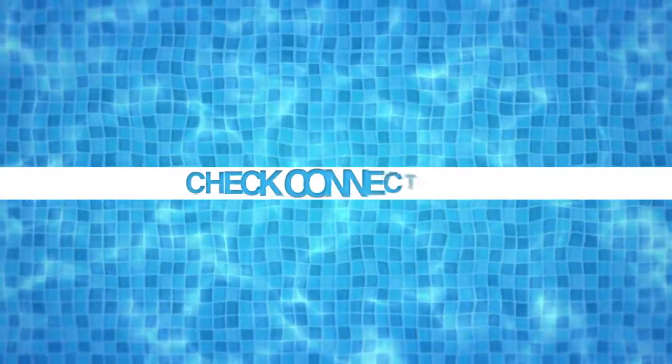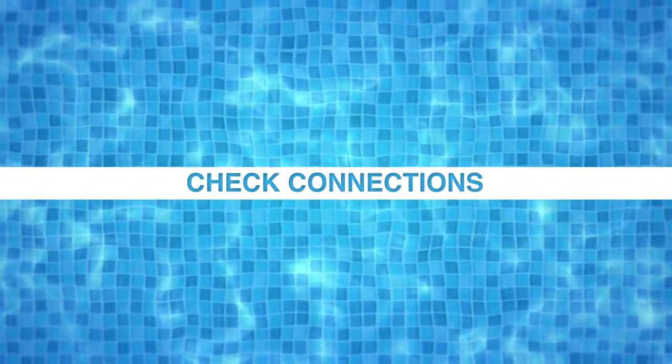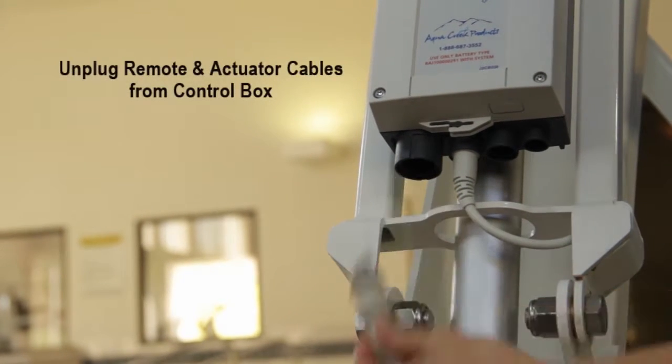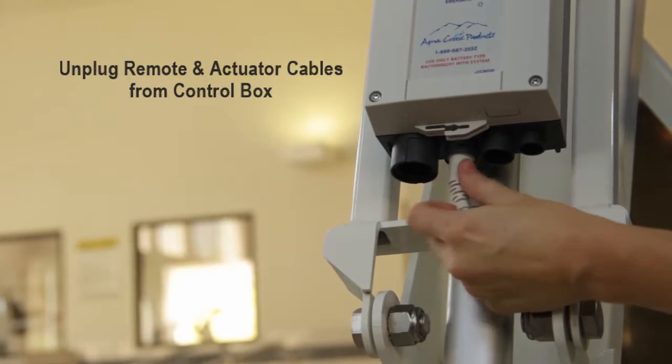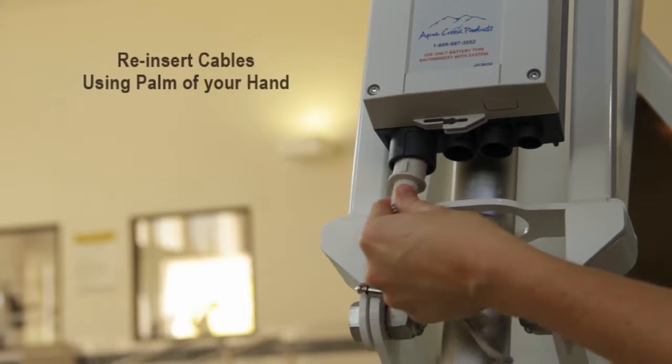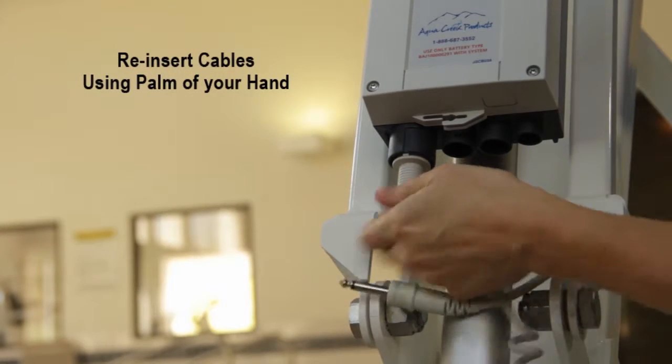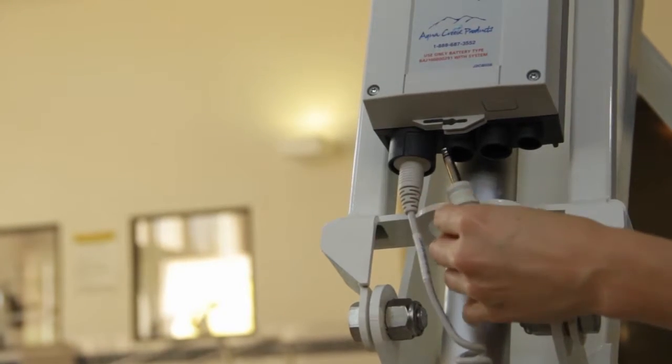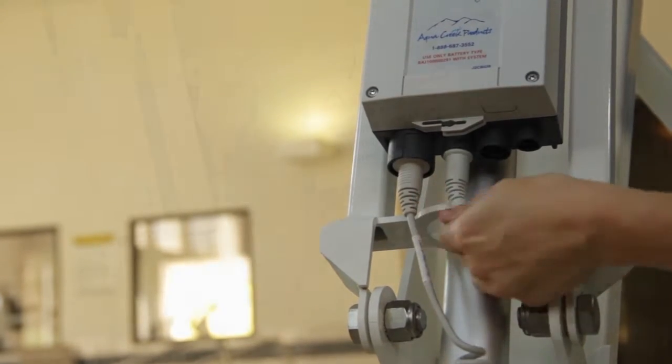If your lift does not retract, check your connections. Unplug the handset cable and actuator cable from the control box. Reinsert the cables into the control box using the palm of your hand. These are watertight connections and can be stubborn.